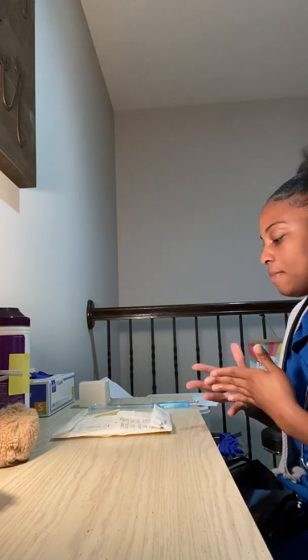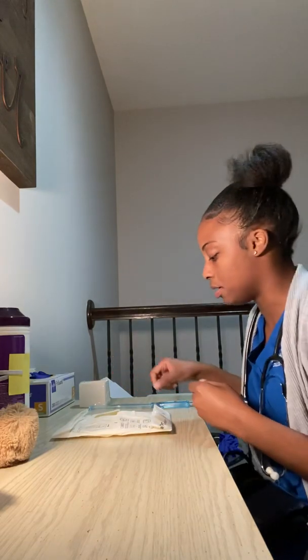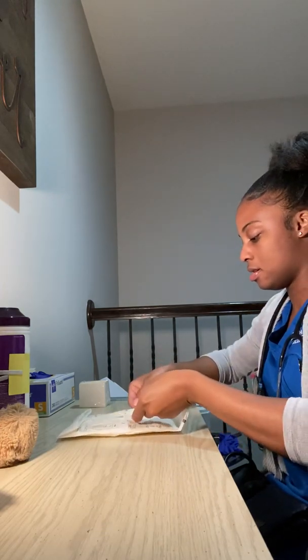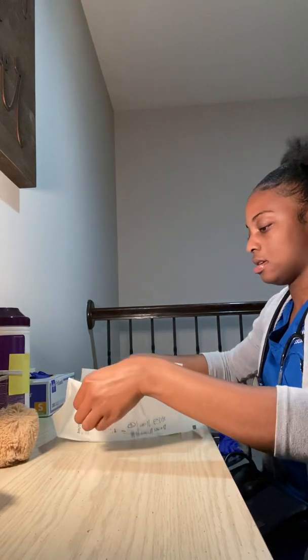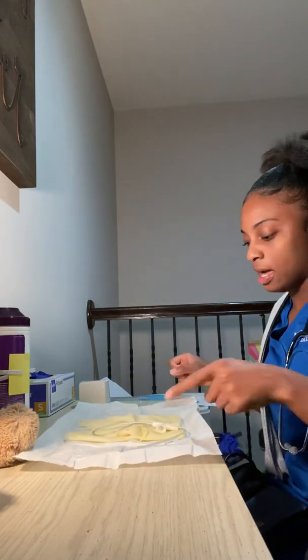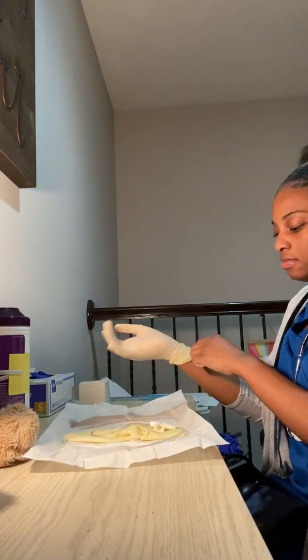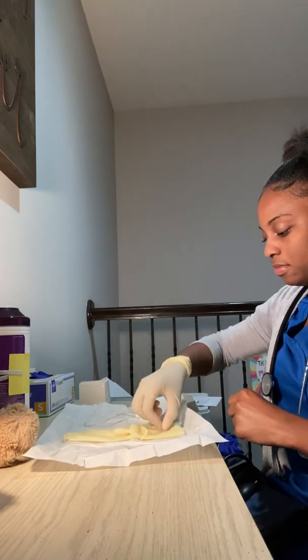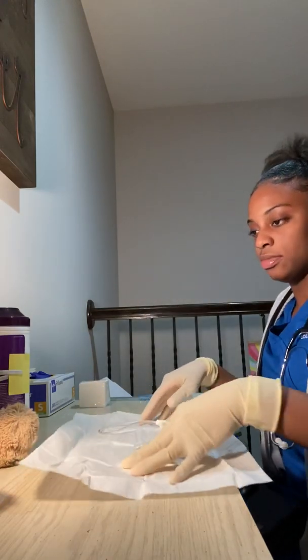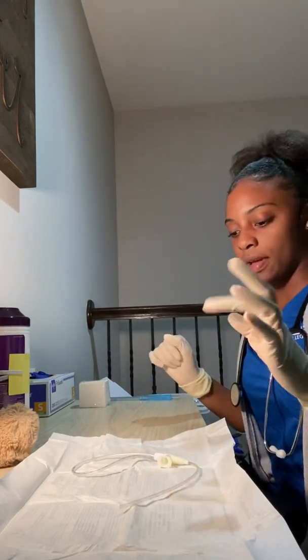Okay, so now that I got my kit ready, I can go ahead and remove my patient's trach collar, and then I'm gonna go ahead and get ready to start. So I can open this up. And I stated that prior to me starting, I'm gonna be hyperoxygenating my patient. My catheter is right here. I didn't have the paper for it still, so I'm just gonna go ahead and put on my sterile gloves. Putting on my sterile gloves. And then I'm just gonna move this off to the side here a little bit so that we can have space. So now that I'm sterile, I've got my catheter in hand.